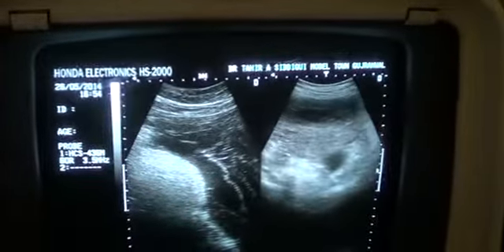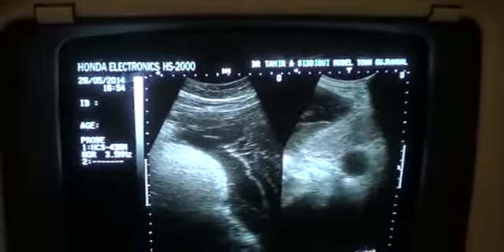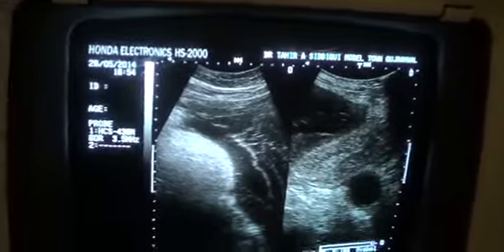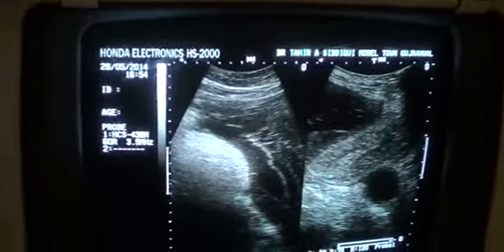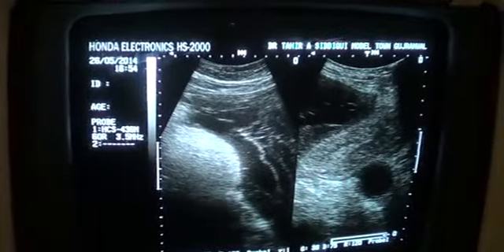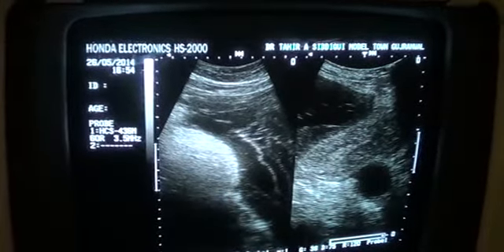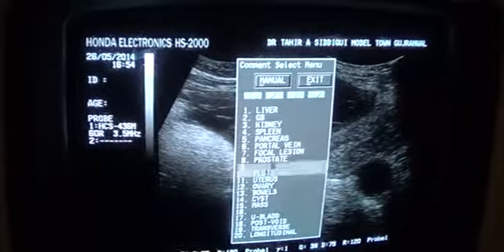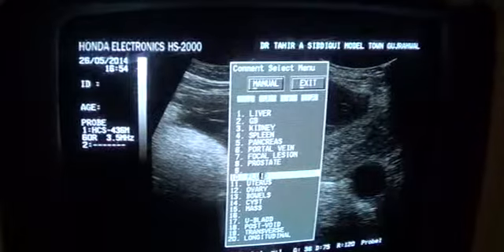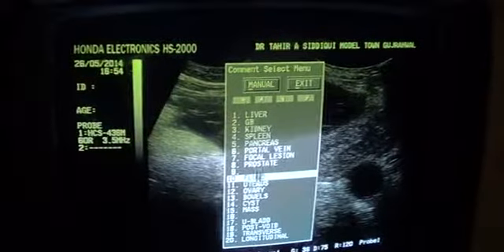I'm not sure, but it can be a bleed as well. The reason we saw the anteroposterior diameter of the uterus was less is because of this large amount of fluid within the pelvic cavity as well as in the peritoneal cavity.